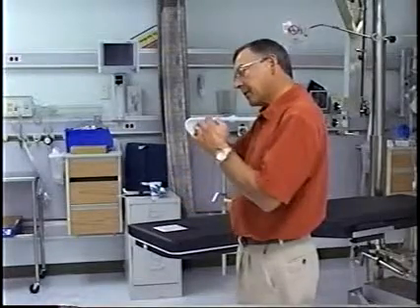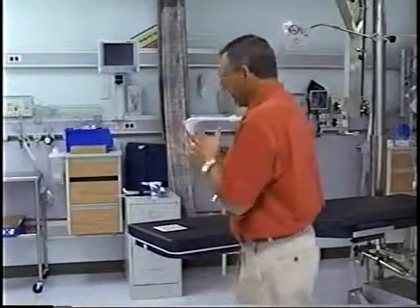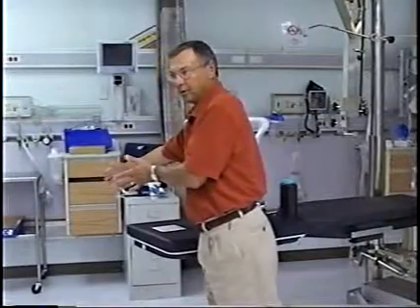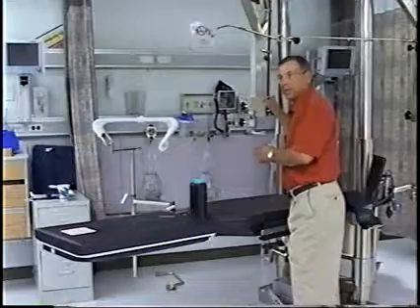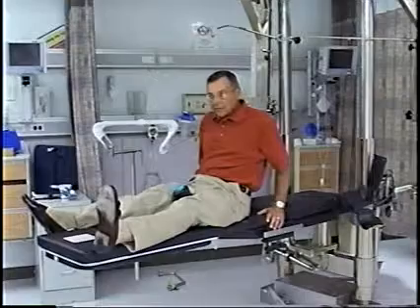But in order to do that hip arthroscopy, if this is the hip, they have to pull the ball out of there, at least partially, which requires an awful lot of traction. I mean, a lot of traction. And in order to do that so that they don't pull the patient off the table, then they'll put them up in bilateral traction. So you wouldn't use this, you would use both of these spars. And the patient would be up in bilateral traction in this configuration. Okay?